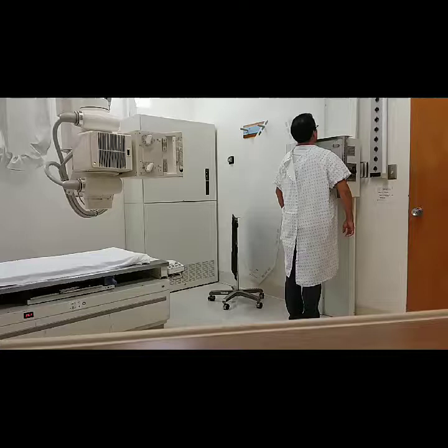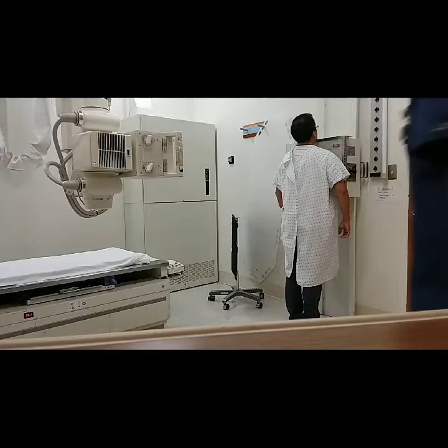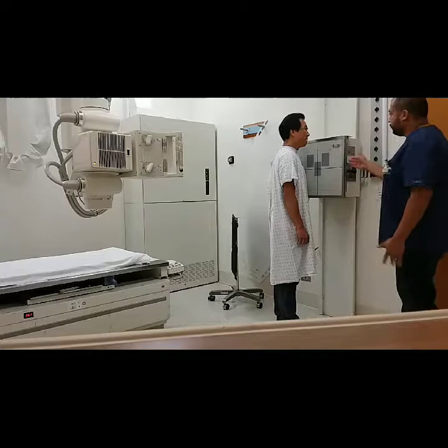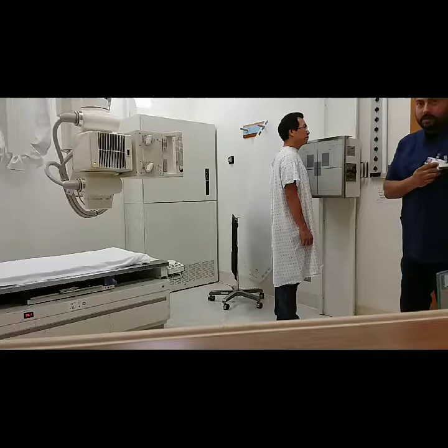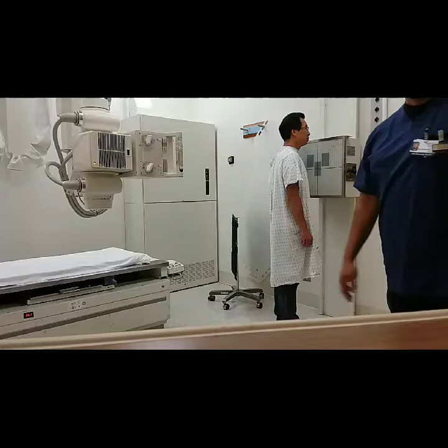Mr. Chen, two deep breaths — hold it. X-ray. Go ahead and relax. Now I will take my image and send it to the PACS system to develop. While that's developing, I will change my technique for the lateral and reposition our patient.